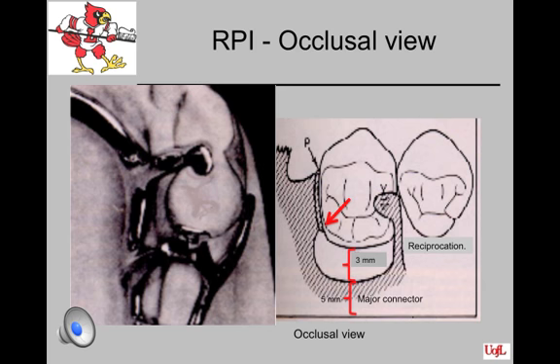The dip down on the lingual must avoid the marginal gingiva by a minimum of 3 millimeters, and the lingual bar major connector must be at least 5 millimeters in width. If the space to the floor of the mouth is not 8 millimeters, then you must plate the lingual on the survey line, which provides minimal torque, or consider another clasping mechanism.